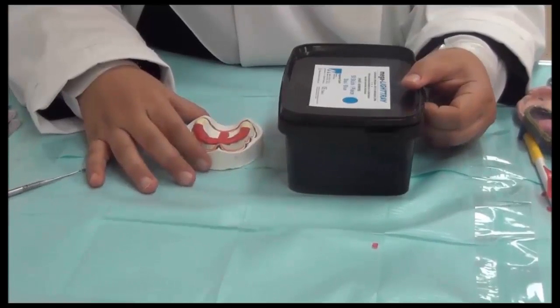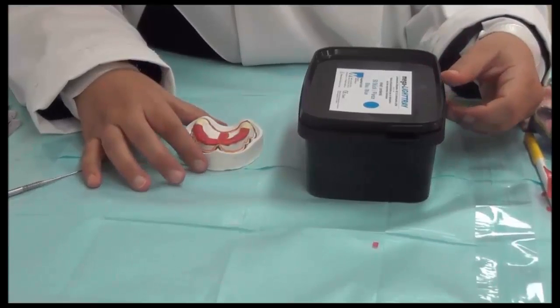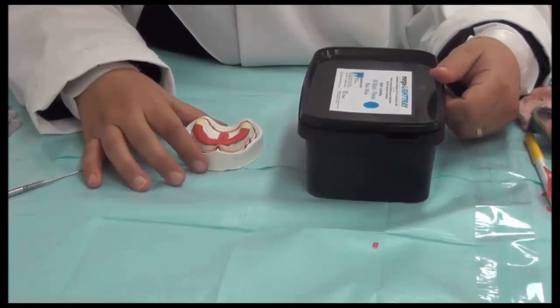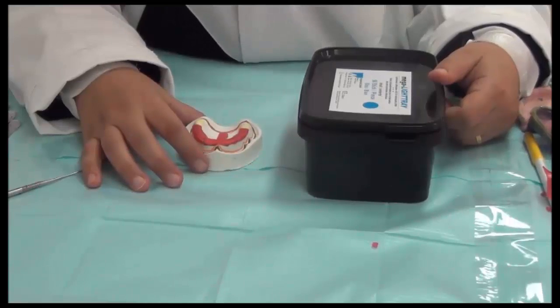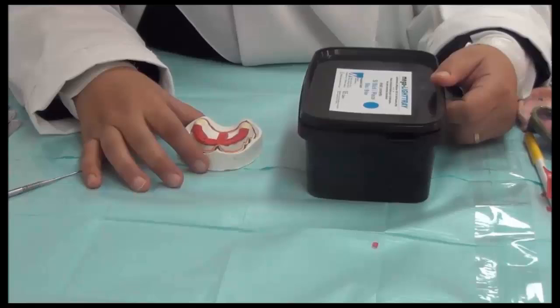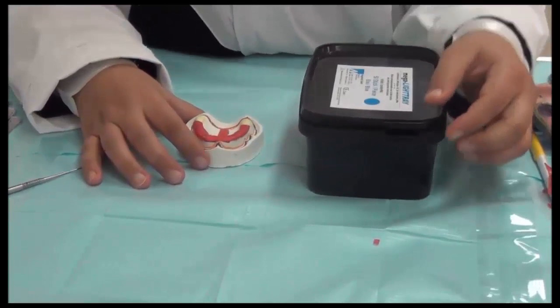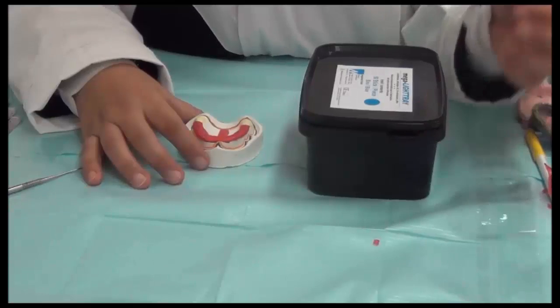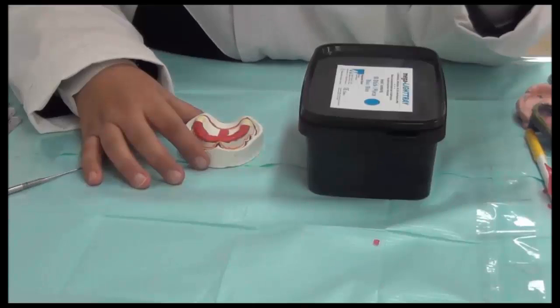Now we're going to do the step where we're going to construct a tray over this space. For trays, we need them to be hard and rigid. So we use a material that is easily shaped, and once it's set it becomes hard, and the suitable material is acrylic. Acrylic can come in light cure or in cold cure method, powder and liquid mixture.